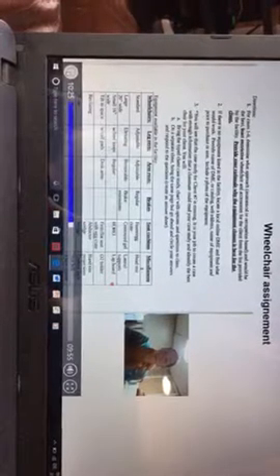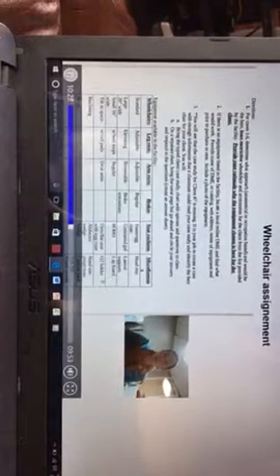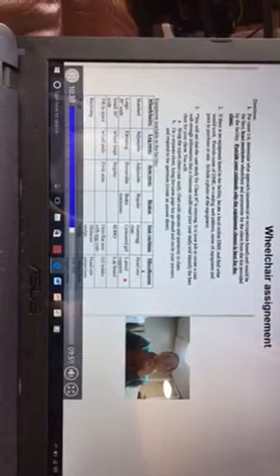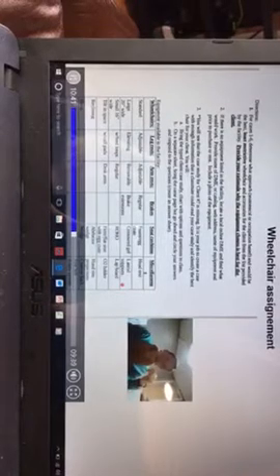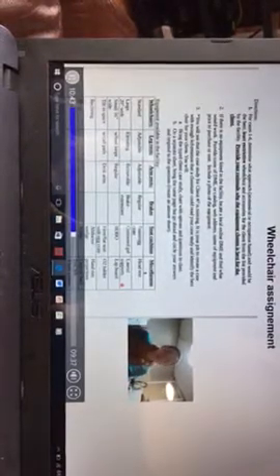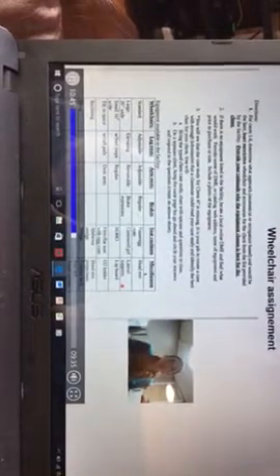And then some of the miscellaneous things to go over real quick would be a headrest. Pretty much anybody with fatigue issues needs a headrest. That's definitely more for somebody who's living in their chair. Lateral supports are for anybody who's got that thoracic lean, they have trunk weakness, but those are more long-term users.